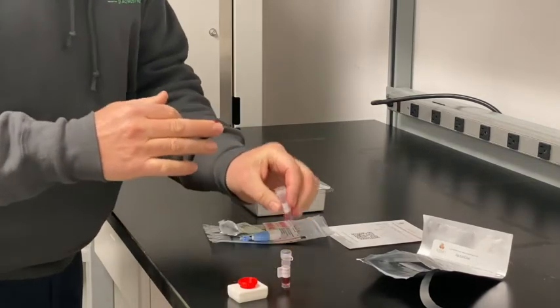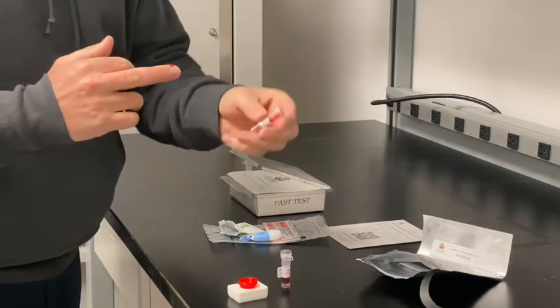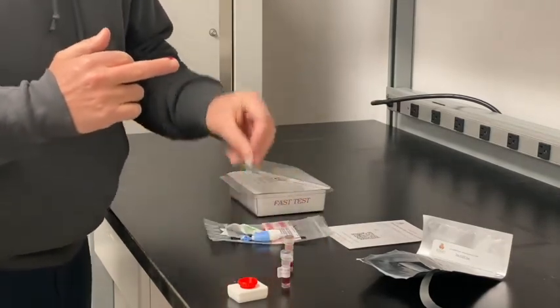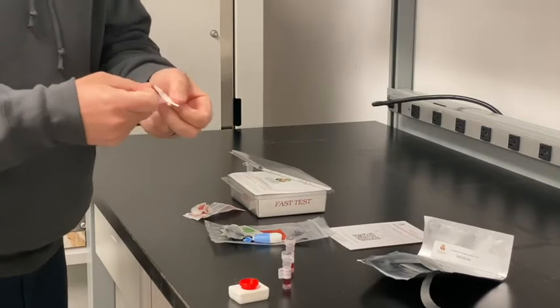Invert three or four times — this will lyse the blood cells and allow it to go through the filter of the red cup. Then apply the band-aid to the side of the finger.